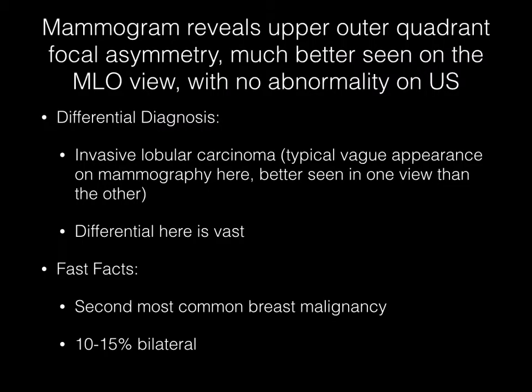Mammography reveals a focal asymmetry in the upper outer quadrant, which is much better seen on the MLO projection than the CC projection. No corresponding ultrasound abnormality is noted. Differential diagnosis should include invasive lobular carcinoma, which typically is better seen on one view than the other. The differential diagnosis list here is vast for this mammographic appearance, however.